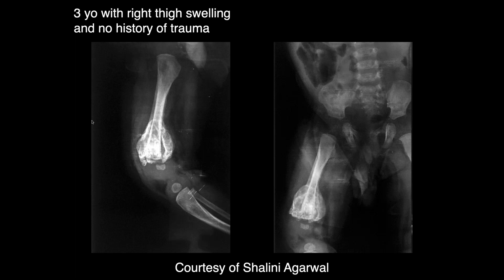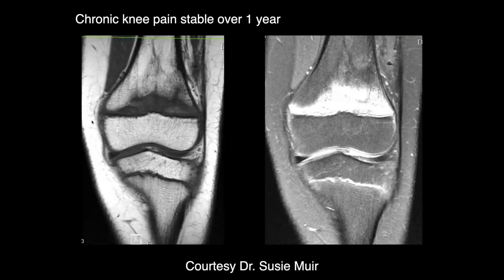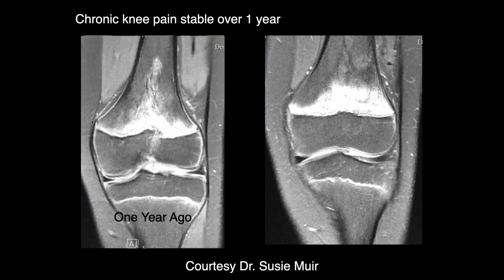Three-year-old with right thigh swelling and no history of trauma. That's a very abnormal-looking distal femur with marked heterotopic bone formation around the femur. The actual femoral cortex itself looks relatively intact — there's just this surrounding bone formation. Looking at two coronal images, T1 on the left and T2 or PD on the right, we can see low T1 signal at the distal femoral metaphysis and increased T2 signal there. Kind of nonspecific; I'd want to see other planes to see if that might be a fracture.